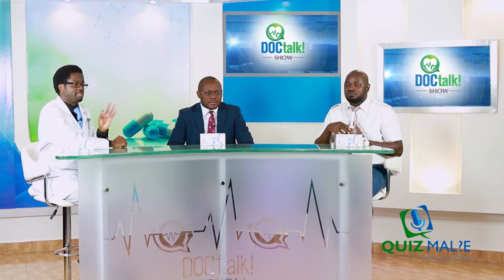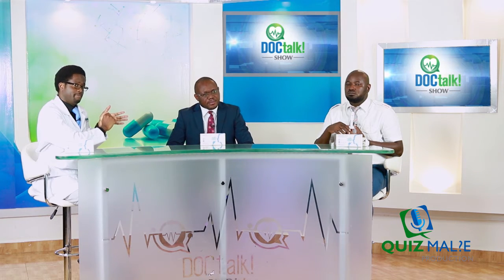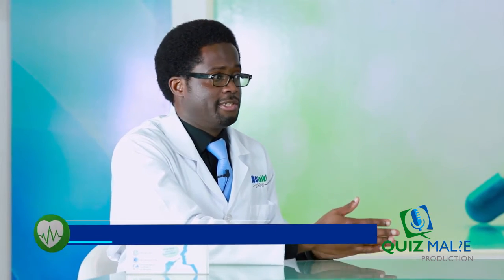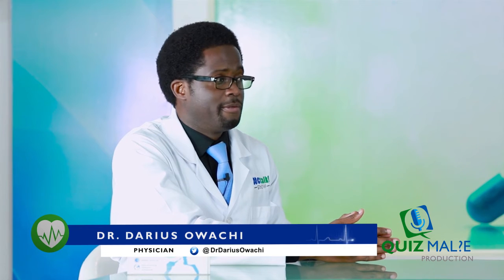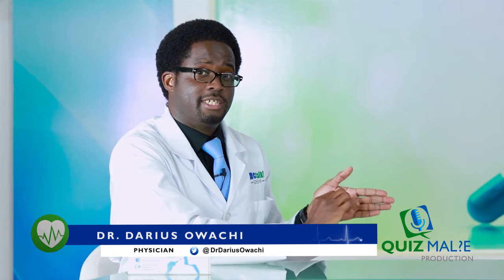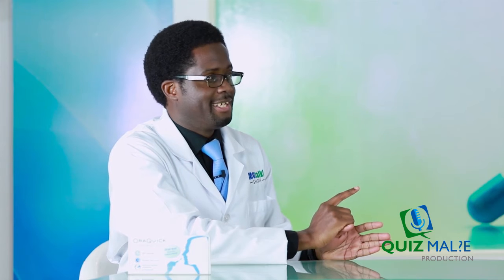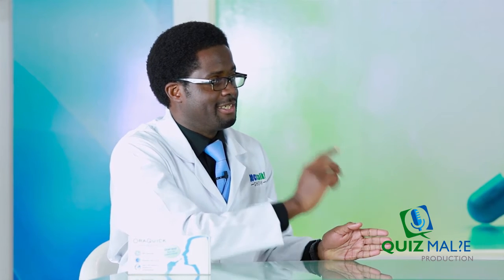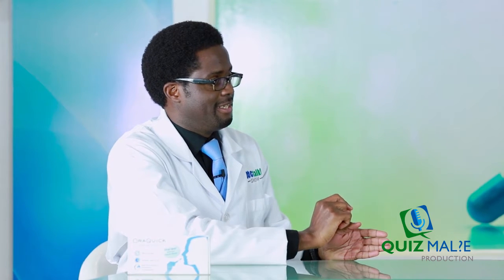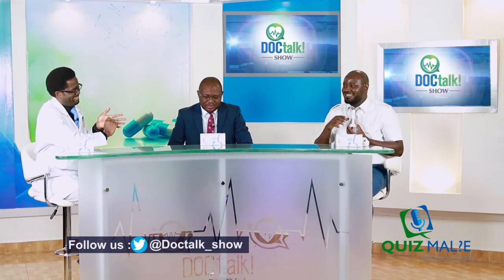So for a correct test, we must have a line where you see the letter C. There should be one line. That means the test is correct and the result it has given you is correct. Like you said, a positive result is when there is a line at the T, and a negative result is when there is no line. Basically, for a negative result there's only one line. For a positive result, there are two lines, at the C and at the T, however faint the lines, even if it's a very faint line.